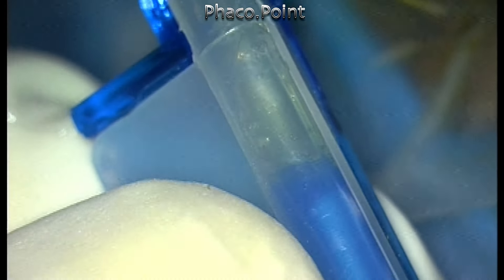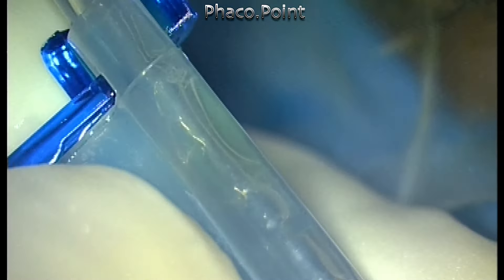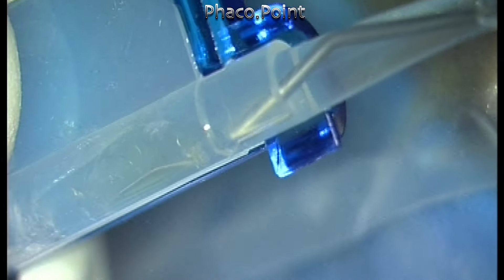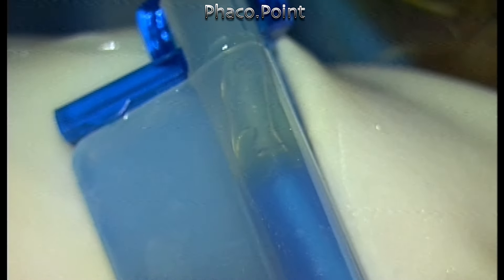When I tried to inject the lens, the lens would simply not budge. Watching the video you cannot judge the force I'm using with the plunger to push the lens into the barrel. I even injected viscoelastic from the other side through the nozzle of the barrel, but even with a lot of force and pressure I was not able to move this lens from the barrel of the cartridge into its nozzle.